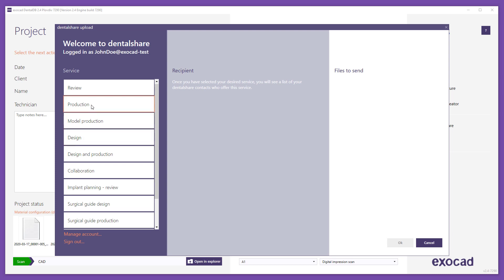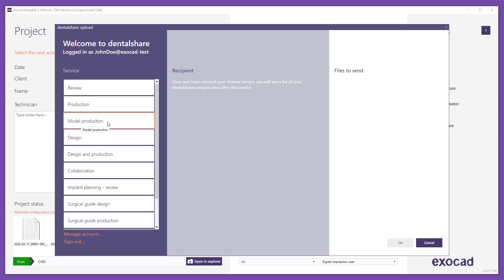By using Production, you can send production data to get the manufactured restoration from your partner. Design and production is used for sending scan files to get the design and manufactured restoration from the recipient. And model production is for sending scan data and model design data to get a produced model from your partner. Other services can be selected.